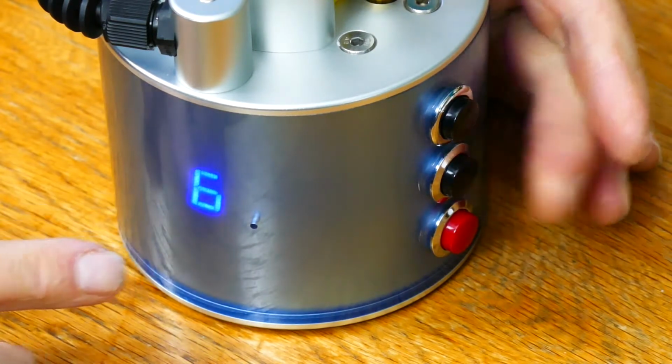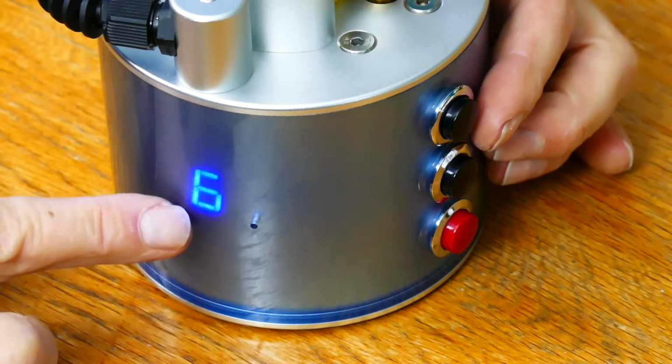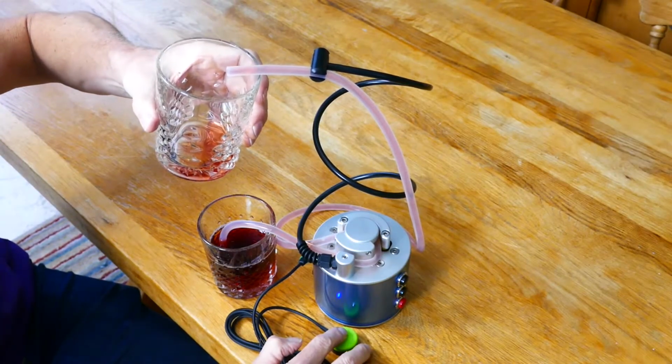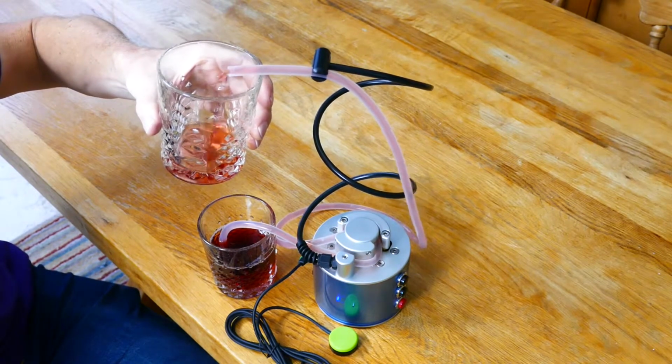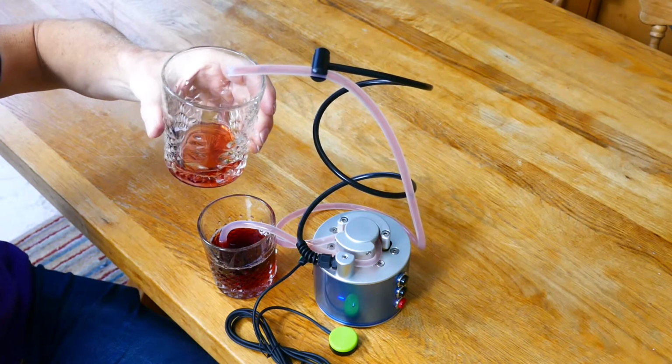When you've selected the number you want, you press the top button again and you'll see a little flash there. The number is now locked in. And when I pump again, you'll see we'll get a larger amount of drink. The measurements that you get each time are recorded in the instruction manual. You can get the milliliter measurements.